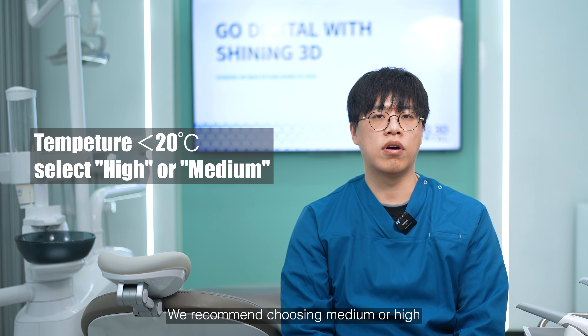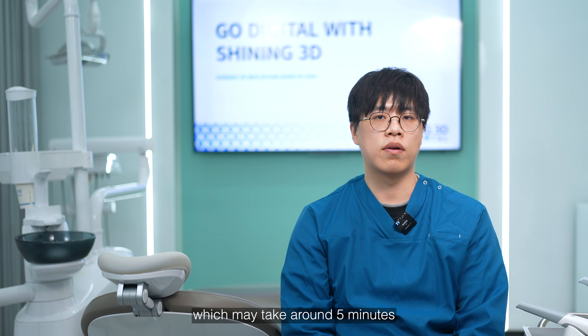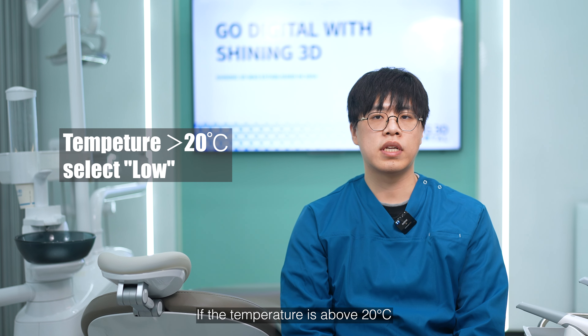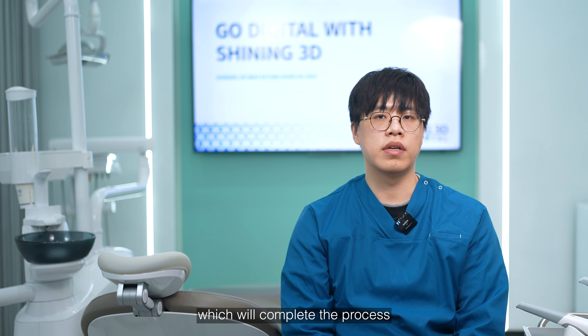We recommend choosing medium or high when the room temperature is below 20 degrees, which may take around five minutes for the heating process. If the temperature is above 20, select low, which will complete the process in approximately three minutes.